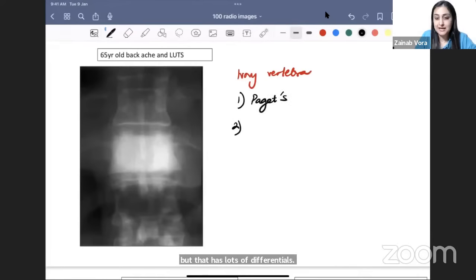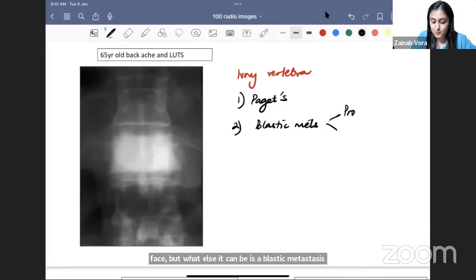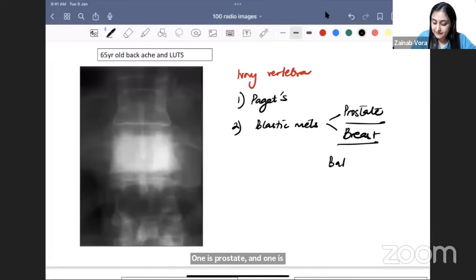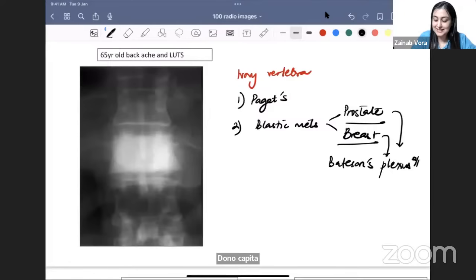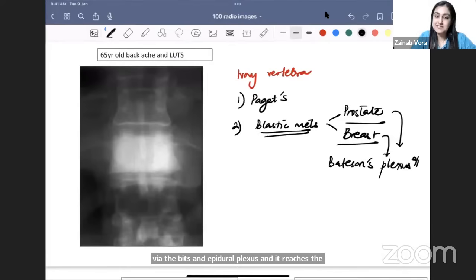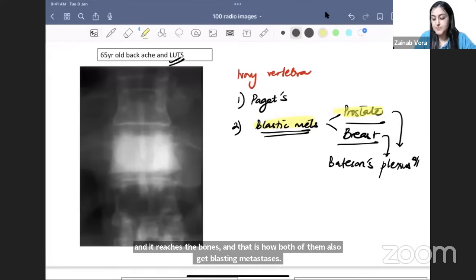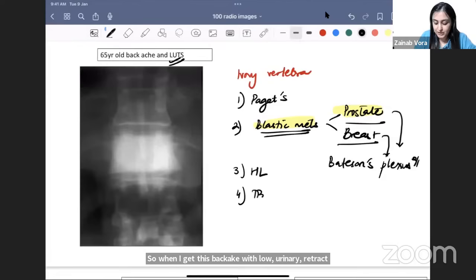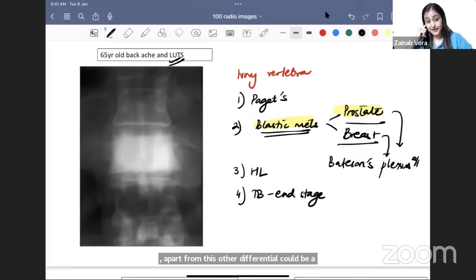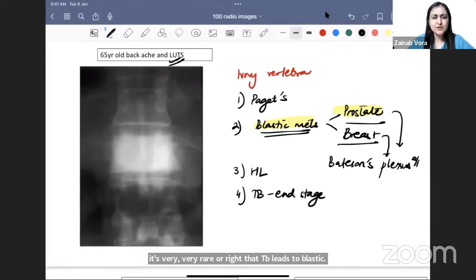There are two main primaries giving blastic metastasis: prostate and breast. Interestingly, both reach the bone via Batson's epidural plexus — from intercostal veins and prostatic veins via the Batson's epidural plexus to the bones. So when I get backache with lower urinary tract symptoms, my top differential becomes prostate cancer metastasis. Other differentials include Hodgkin's lymphoma and very rarely end-stage tuberculosis or osteosarcoma involving the vertebra.